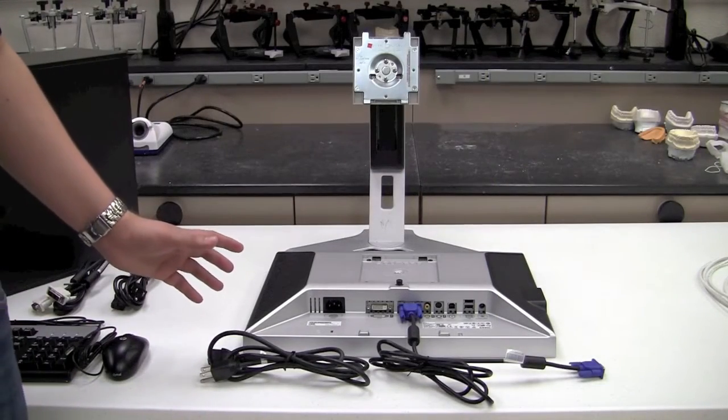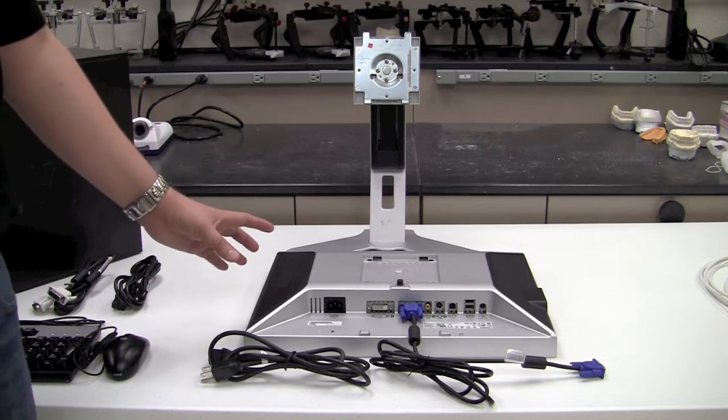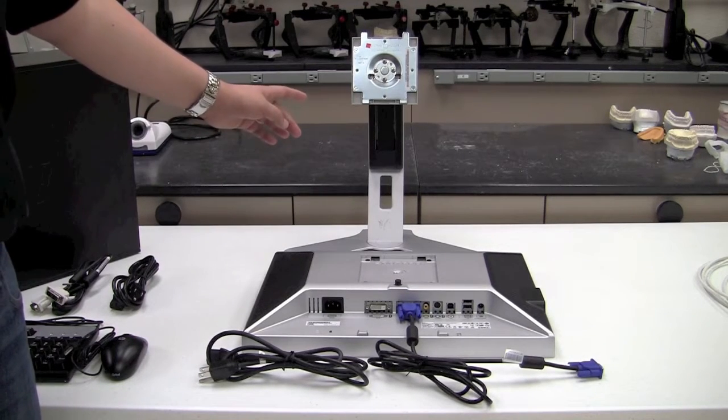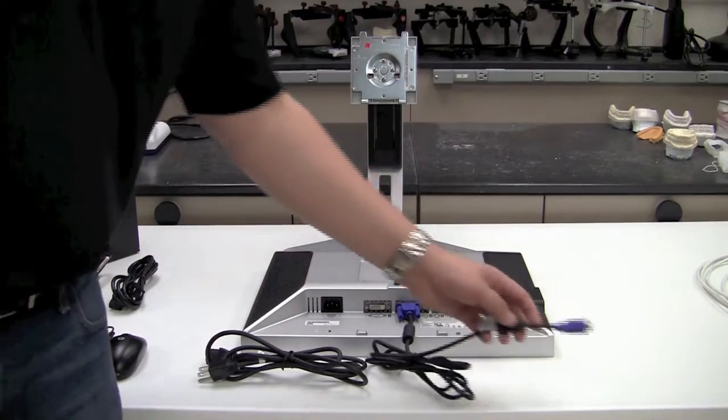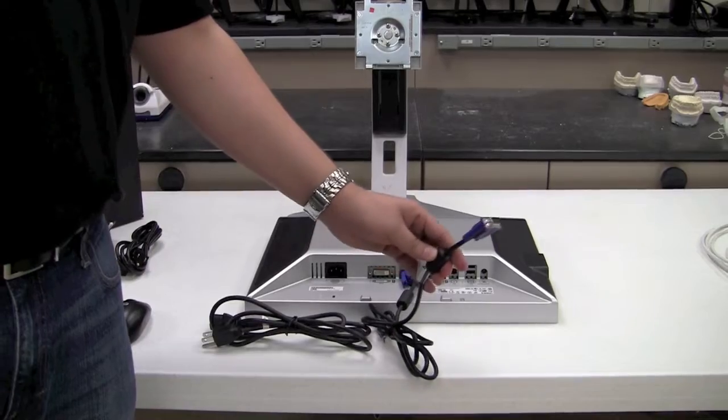The second item that you'll need for your 3Shape system is going to be the computer monitor. The monitor will typically come separate from the actual base itself, and it will usually come with a VGA cable included. You can typically recognize the VGA cable by its blue color.